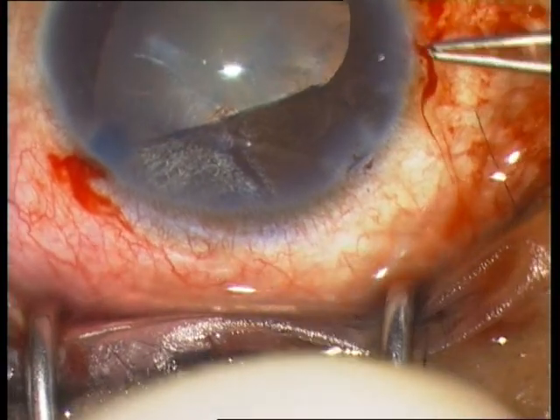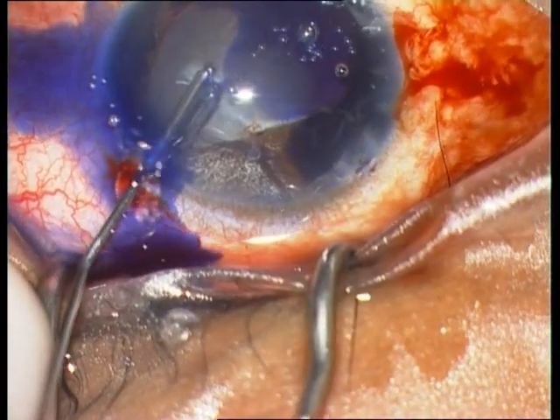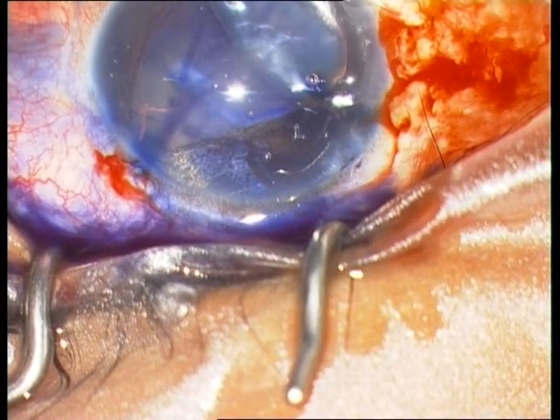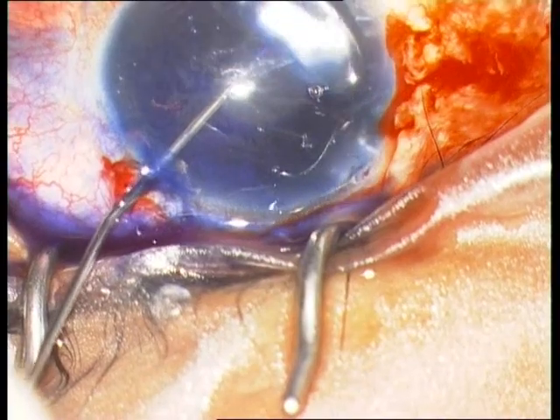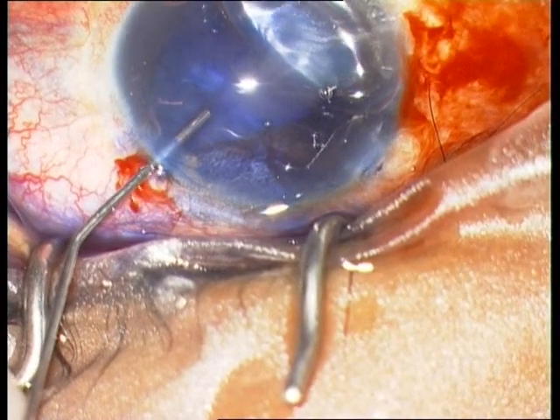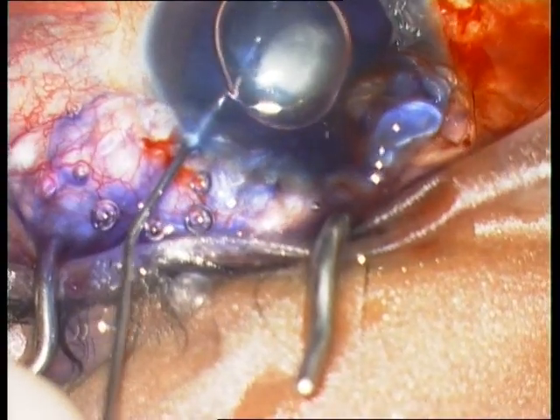Until now I have only removed a membranous structure located on the anterior capsule. I therefore inject vision blue again, because the membrane was covering the anterior capsule and the dye did not reach it. So another staining of the anterior capsule, followed by removal of the vision blue from the anterior chamber.